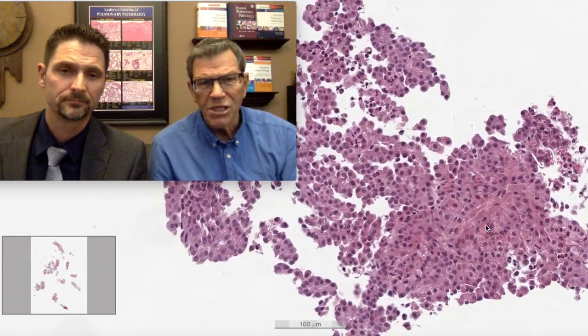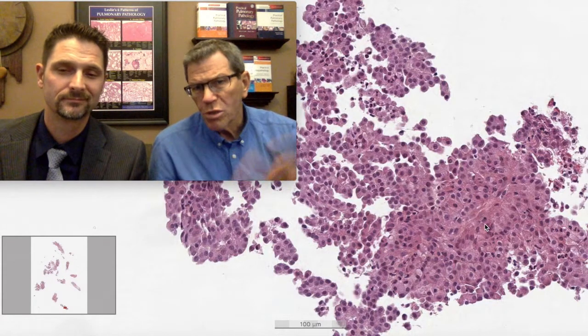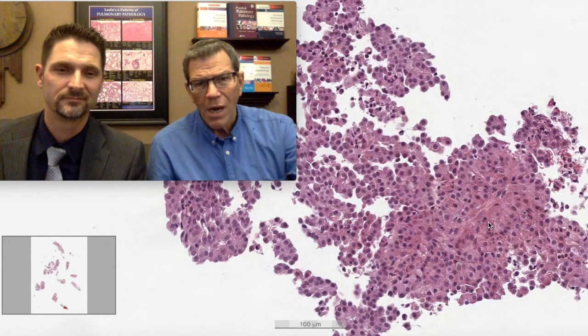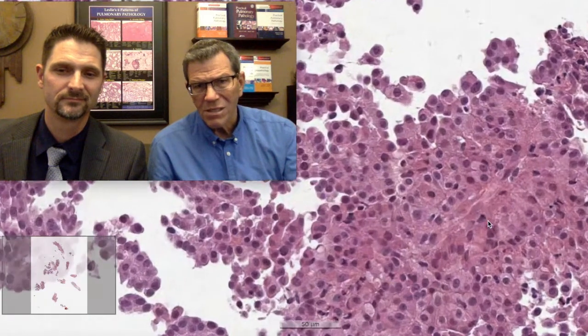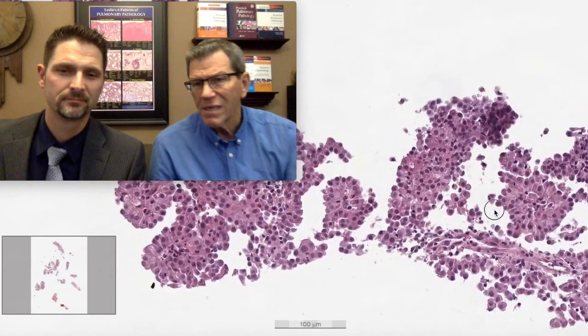Exactly. First, really shake the tree hard to make sure that it holds, because once you make a diagnosis of mesothelioma, you open up Pandora's box for a bunch of reasons, which we may get to, or we may have to do another video at some point. But how are you going to make that diagnosis, Max? Well, once we've gotten to features of malignancy, and I think the infiltration of those few glands are definitive features of malignancy, the cytology is low grade, but I'm quite concerned it's malignant as well.